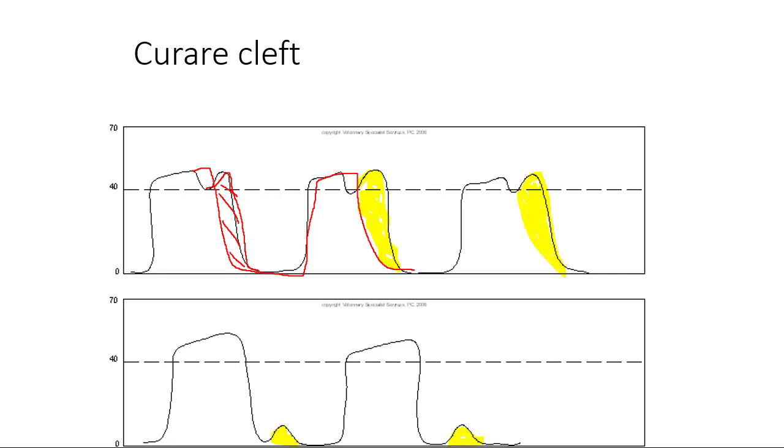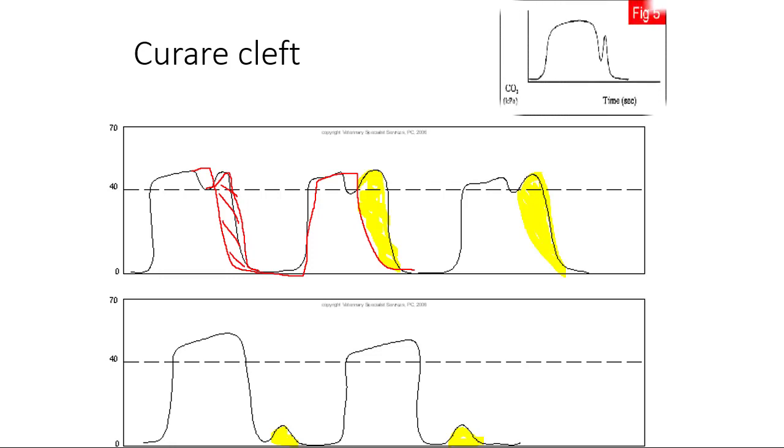Anyway, so some other things I would look at for this, just a little clinical pearl. It doesn't always have to be the same shape. It can be little notches. I've seen little bumps, but you can also look at their heart rate. Sometimes you'll see the heart rate increasing before you see this. That's a sign of pain response. Another sign they need, if their blood pressure tolerates it, more sedation. Cool?